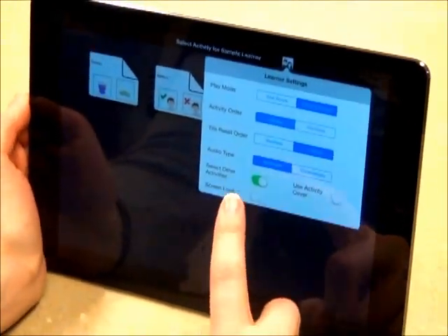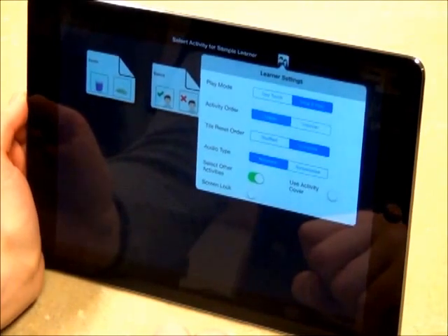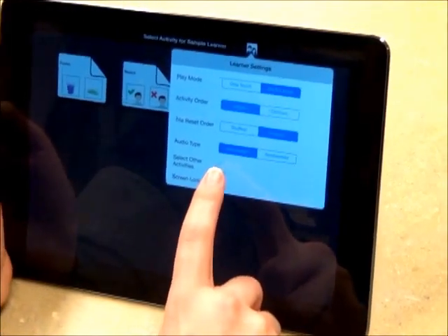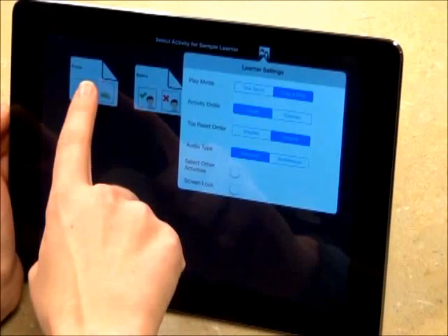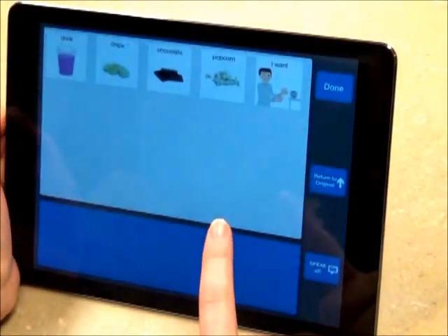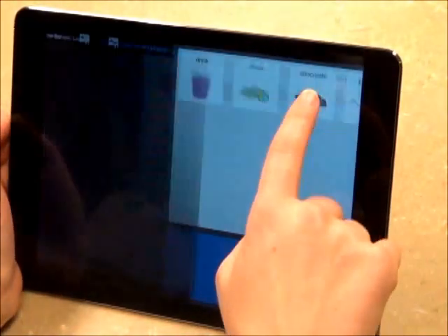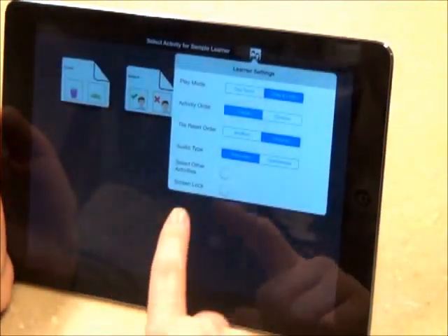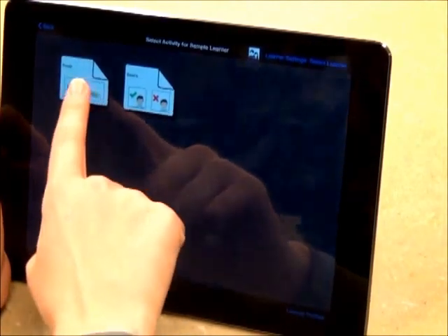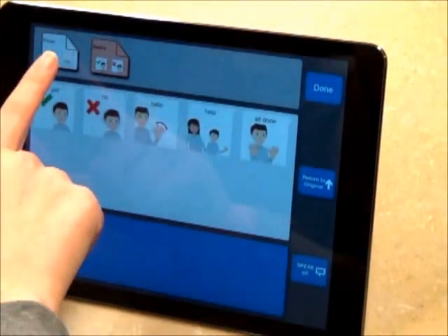Audio type lets you choose between pre-recorded speech and synthesized speech. When Select Other Activities is turned off, I am locked into a single activity sheet, whichever one I press. When Select Other Activities is turned on, I may switch between separate activity sheets.